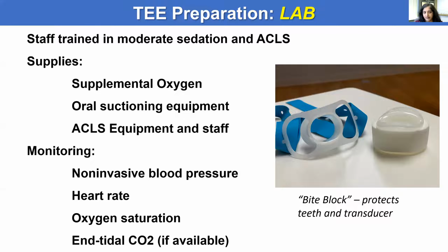The lab also has to be prepared for TEE. So staff trained in moderate sedation and ACLS, these are the supplies you need, and this is the continuous monitoring that's required for oxygen saturation, heart rate, non-invasive blood pressure every 2 to 3 minutes. And end-tidal CO2, if available, can be quite helpful in alerting you to a decreased responsiveness or decreased breathing in a patient before the O2 sat fails.